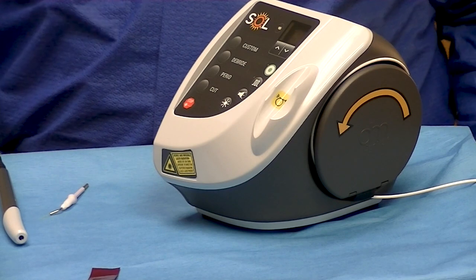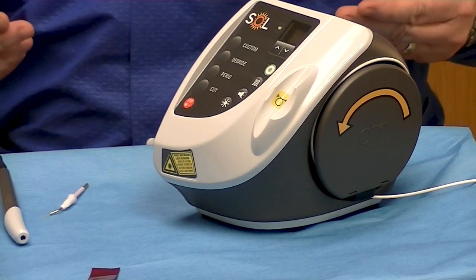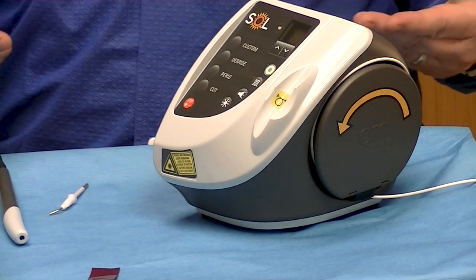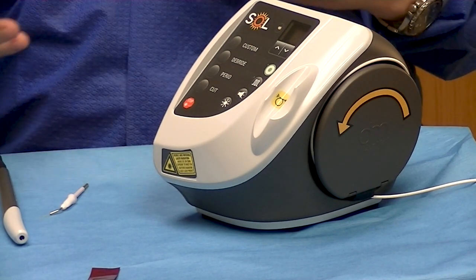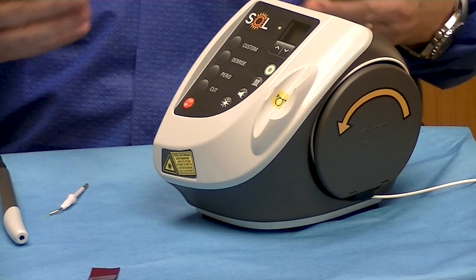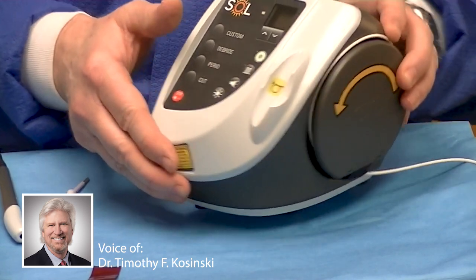I want to take a few minutes and show you the second laser that we use in our practice, the Sole. It is also wireless and has a remote foot control. It does have a charger where you can charge it. I just want to go through the process because it's very simple to use and we'll demonstrate.